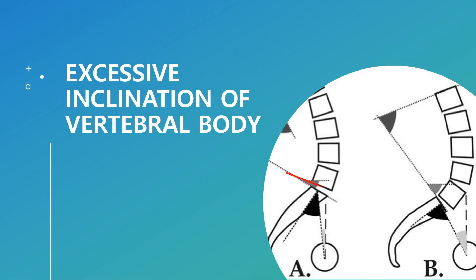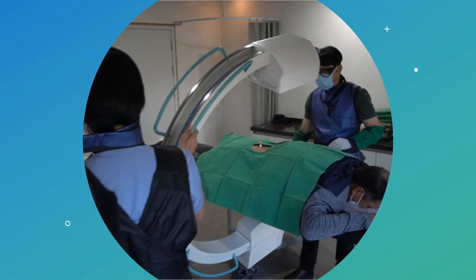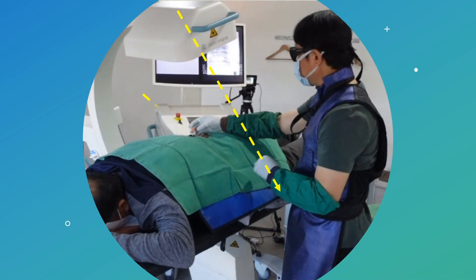Excessive inclination of the vertebral body on a sagittal plane — it is the second challenging type. The inclination angle of the L5 vertebral body is larger than the standard variation. Please compare with the previous patient. To align the inferior end plate of the target, I have to tilt cranially to the extent of the inclination angle. Please look at the C-arm cranial tilting angle. The needle has to follow the same angle as the C-arm inclination. This makes it challenging to control the needle — more angulation, more difficult.